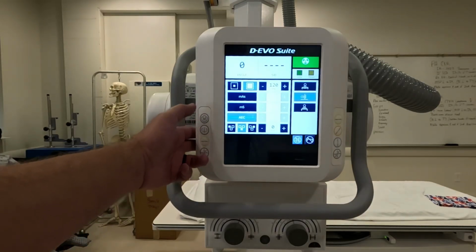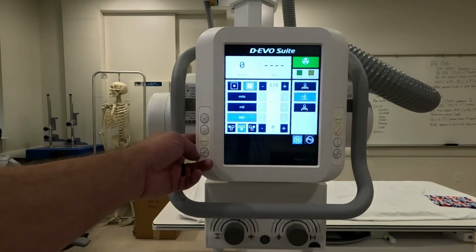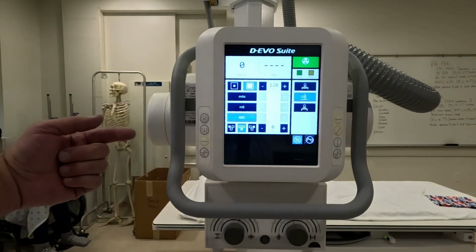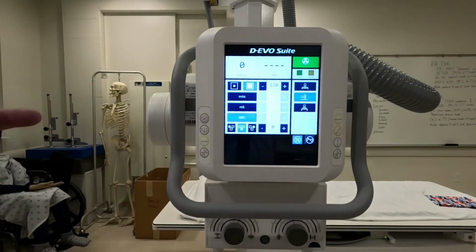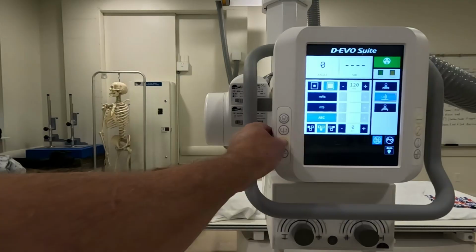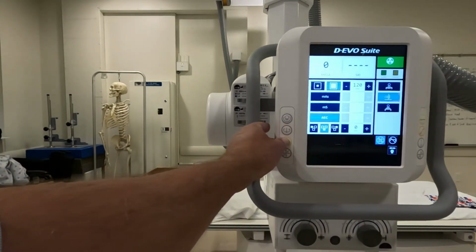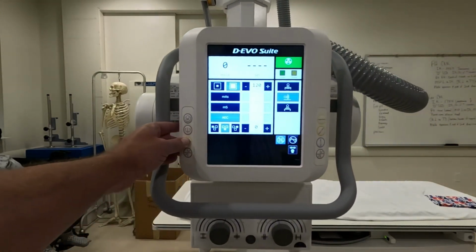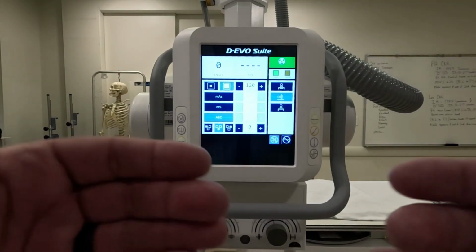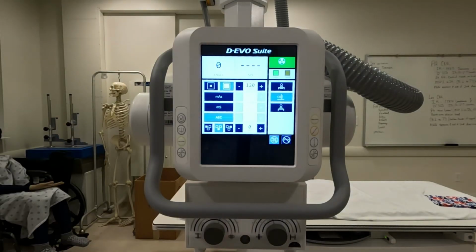So if you look at the buttons and study them pretty closely, you can figure them out. This one's got a line and an arrow that goes in two directions. So naturally that's going to be what you use for your longitudinal centering. You can see the X-ray table right there. So longitudinal means with the long axis.